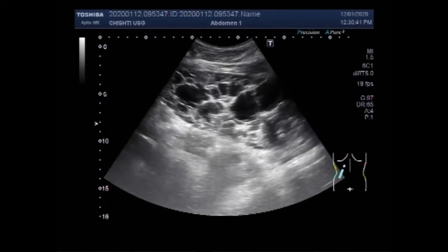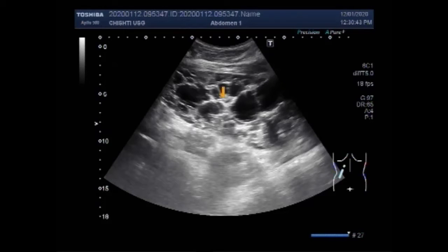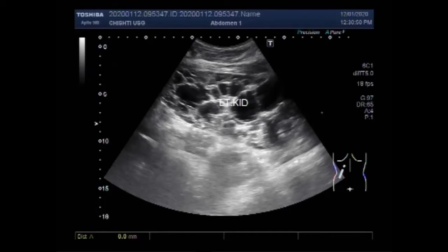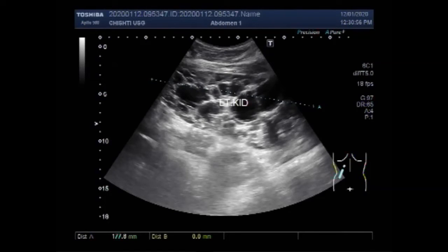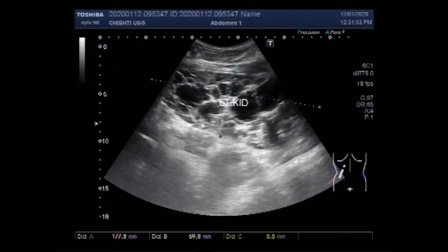There is compensatory hypertrophy. You can see the left kidney and its size. It measures 17.8 cm x 7.0 cm with a cortical thickness of about 7.5 mm.